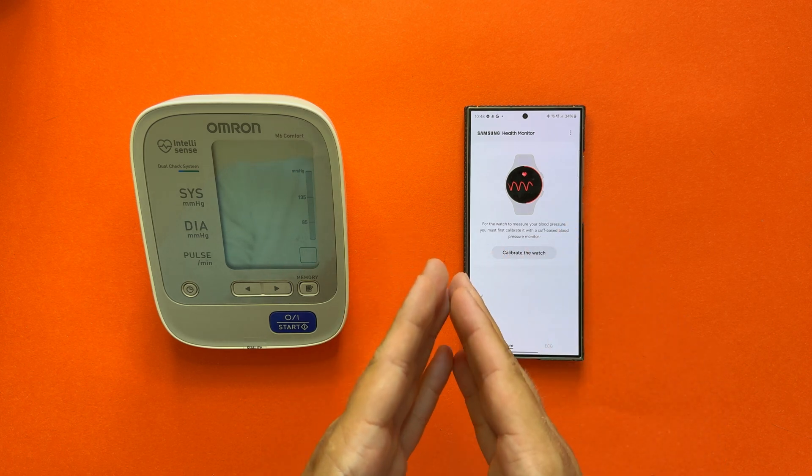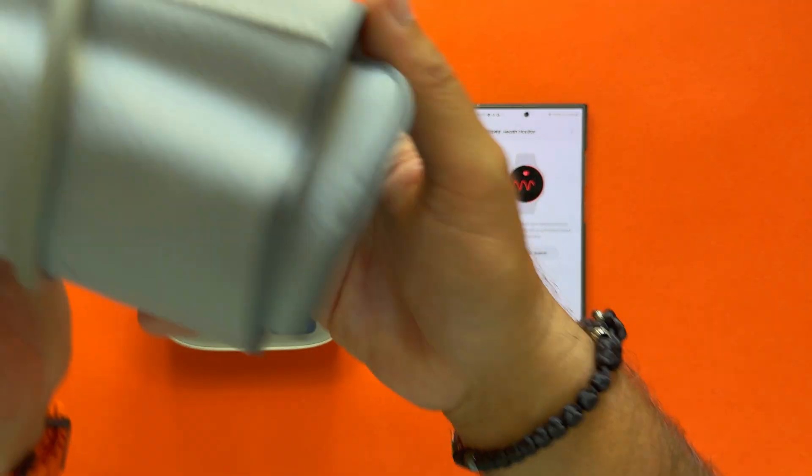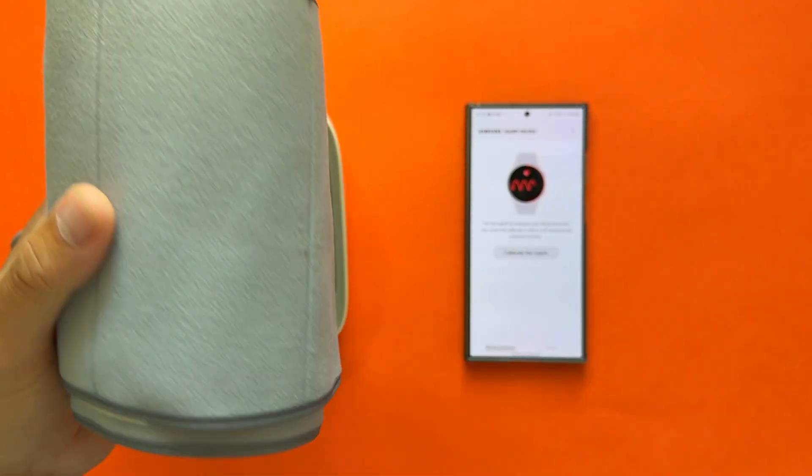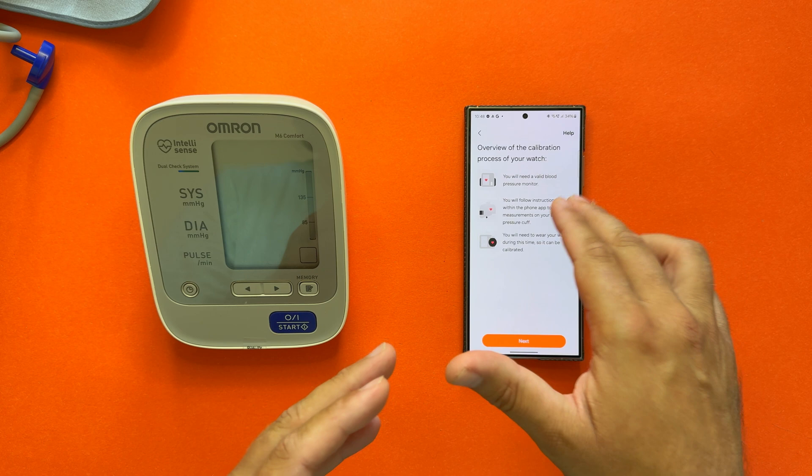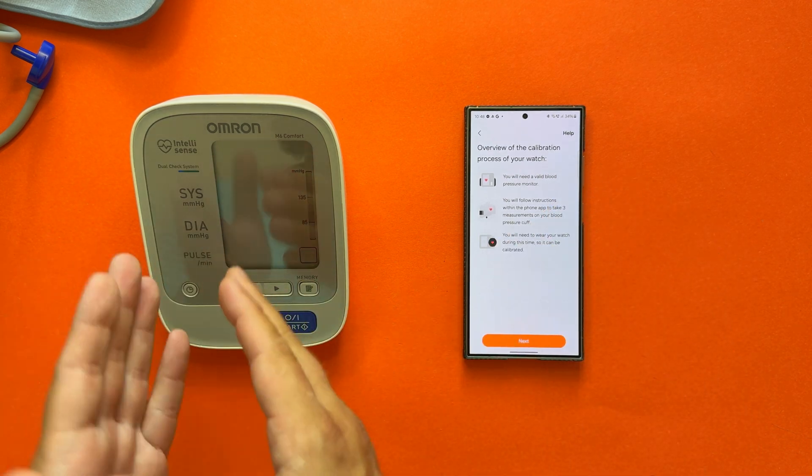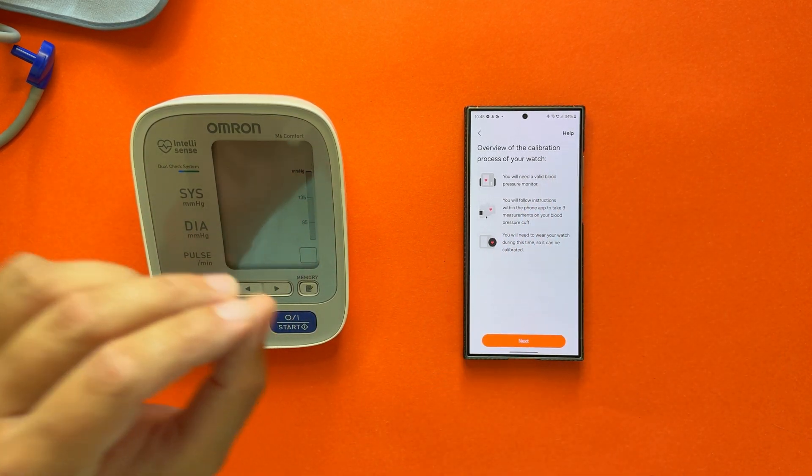For the watch to measure your blood pressure, you first must calibrate it with a cuff-based blood pressure monitor. So this is the blood pressure monitor I have here, also the cuff that I'm going to attach to my arm. Now I'm going to hit 'Calibrate watch'. You will need a valid blood pressure monitor. You need to follow the instructions, and you're about to make three measurements.